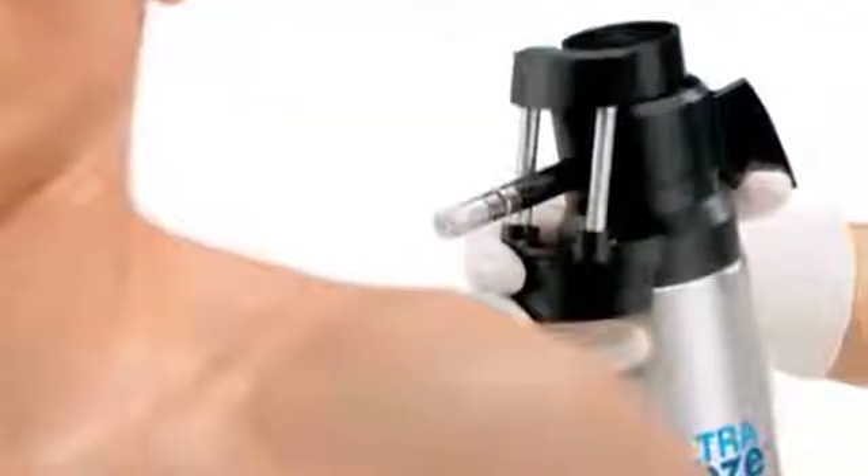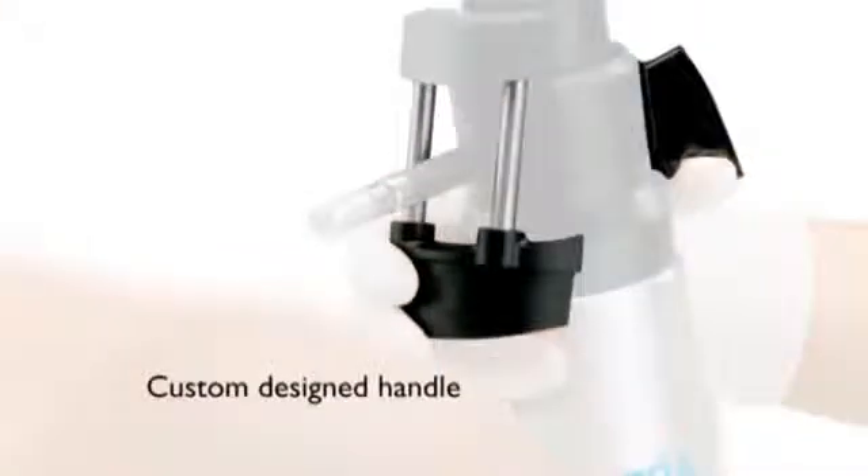The Comfort Grip ergonomic handle helps to stabilize the unit for exceptional precision and control. The custom designed handle can be used in either hand.